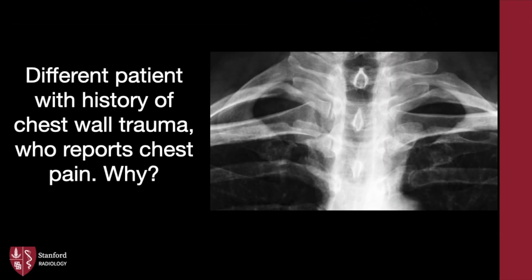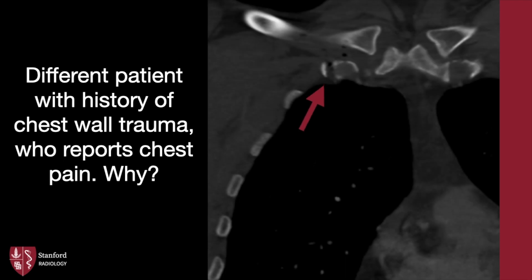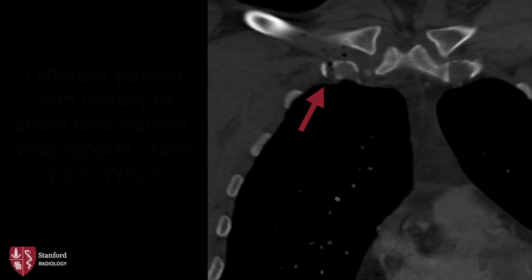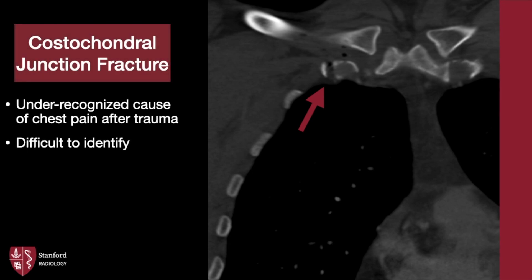This is a different patient, also with history of chest wall trauma and now with chest pain. Our zoomed-in frontal radiograph is not too revealing. A follow-up CT reveals the answer: this is a costochondral junction fracture of the right first rib. Note how there are foci of gas tracking into this region. It is a commonly unrecognized cause of pain after trauma, as this area may appear very heterogeneous, especially in elderly individuals.